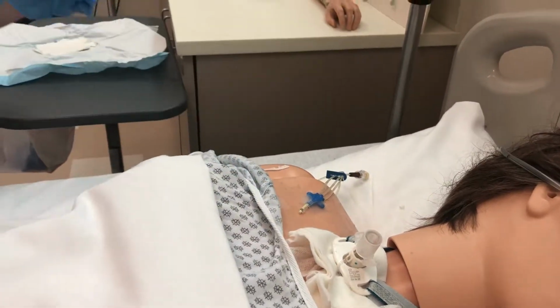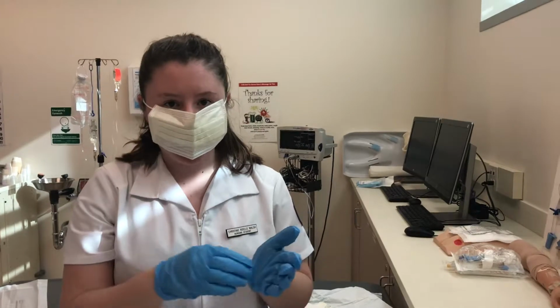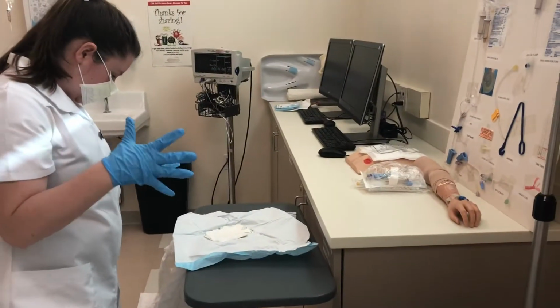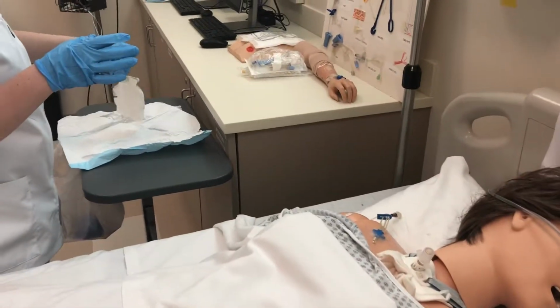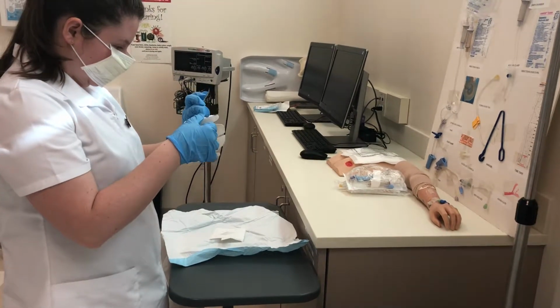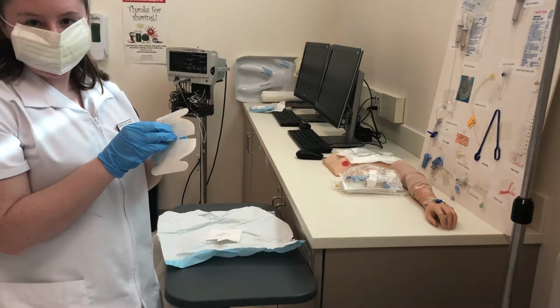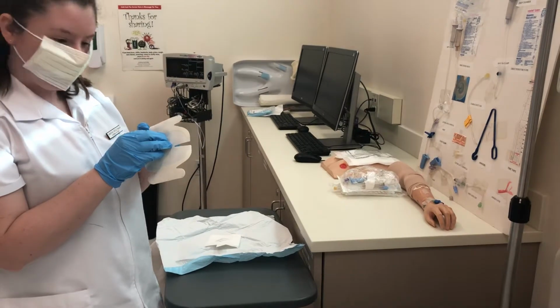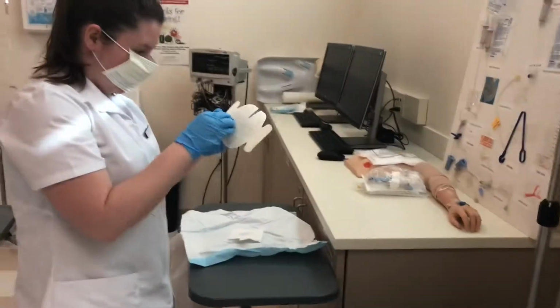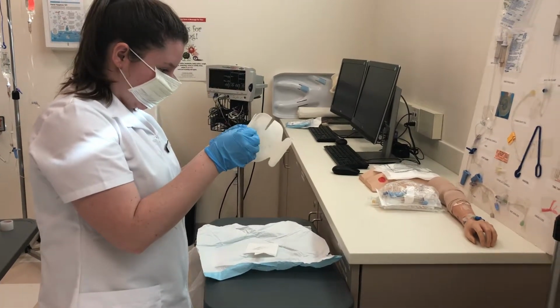Okay. So now that my site is clean, I'm going to throw this away. I'm going to let the skin dry for a couple of seconds. Still waiting on that being dry. Okay, so that looks about dry. And we are going to put our dressing on.